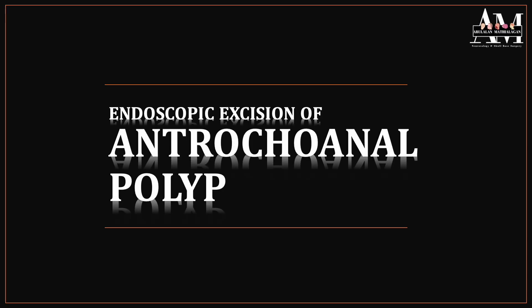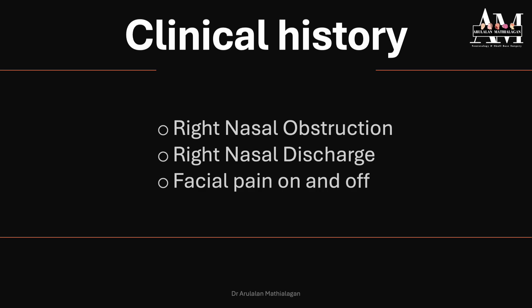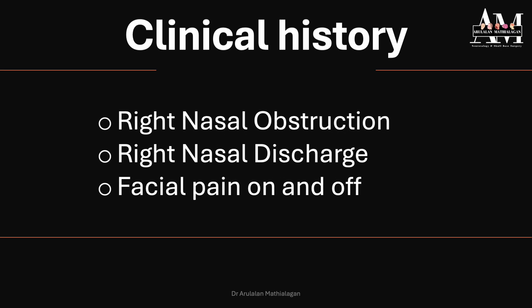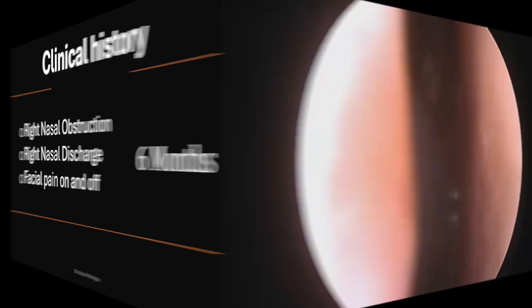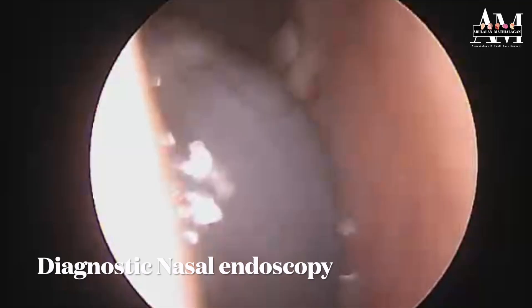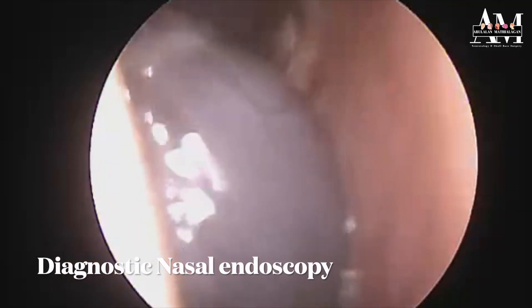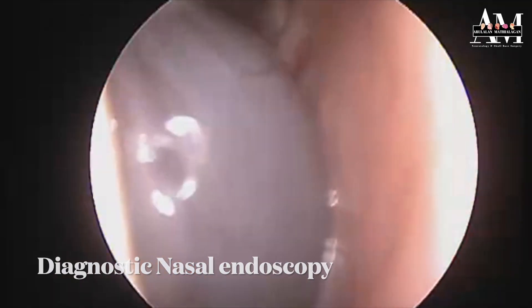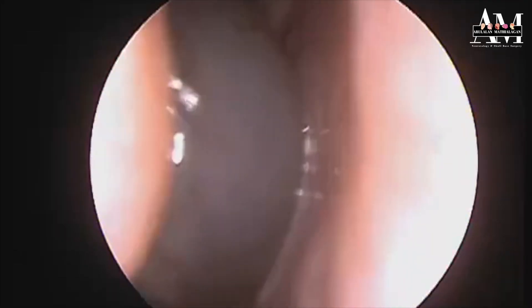In this video I will be describing endoscopic excision of an antrochoanal polyp. This was a young patient with history of right-sided nasal obstruction, discharge, and facial pain on and off for the past six months. On diagnostic nasal endoscopy we could visualize a pale polypoidal mass involving the middle meatus, and the floor, and the imaging also shows the same.